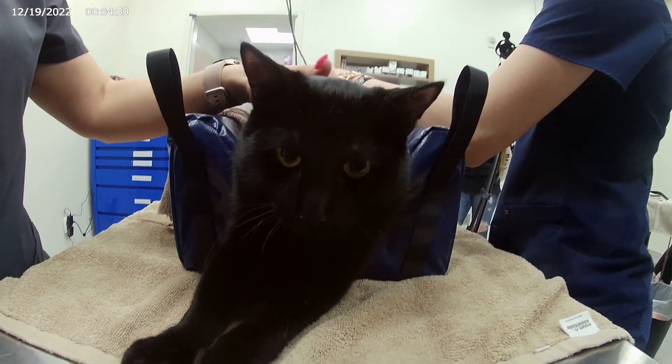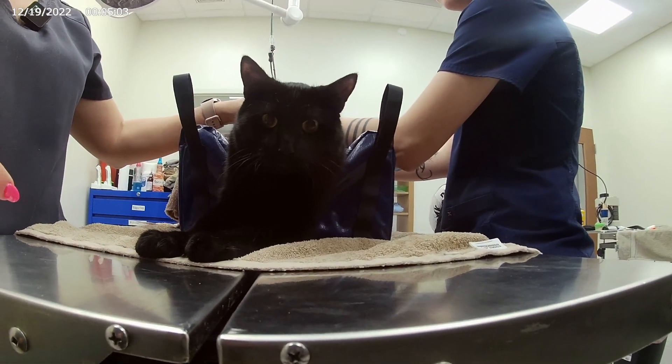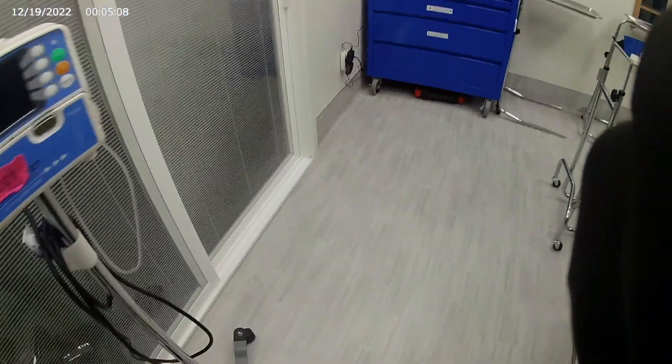This is our kitty — he is a rescue cat and he is super sweet. He has had some lower urinary tract issues, meaning he has some blood in his urine on occasion, and we're gonna check to make sure it looks good today.